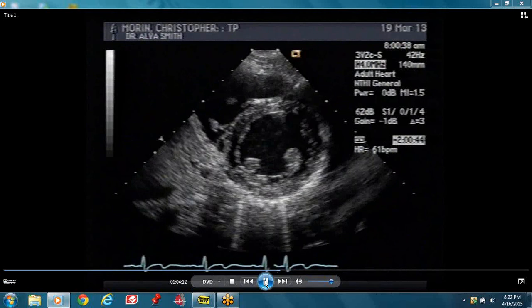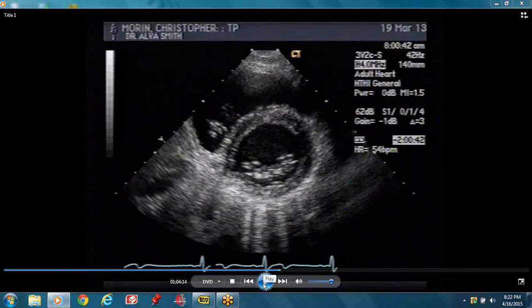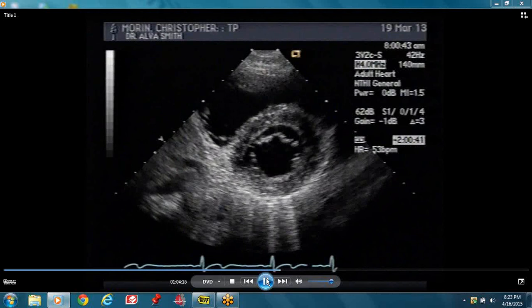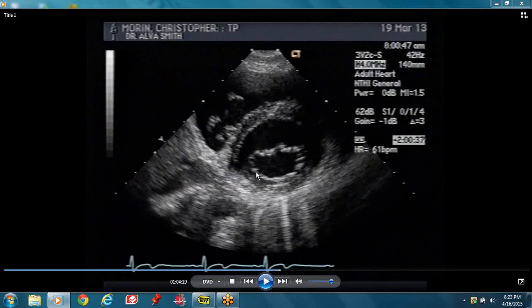You can see the nice papillary muscles, then you go into the short axis of the mitral valve. You have the anterior leaflet on top and the posterior leaflet below. This is the view where you can plane the opening of the valve — you make sure you have full opening of the valve and then you plane the interior of the valve and it will give you the valve area.